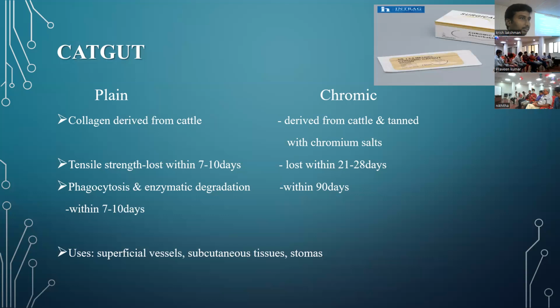Circumcision, I would urge all of you to use plain catgut, because the chromic catgut will become like barbed wire after some time. Hurt them a lot. And you don't want that. So use plain catgut.